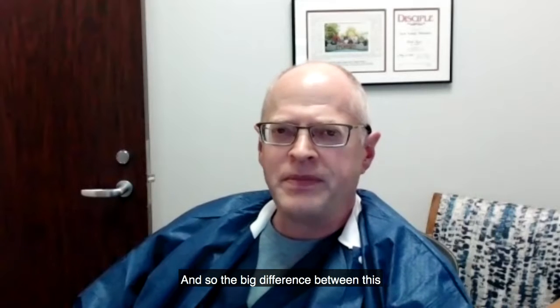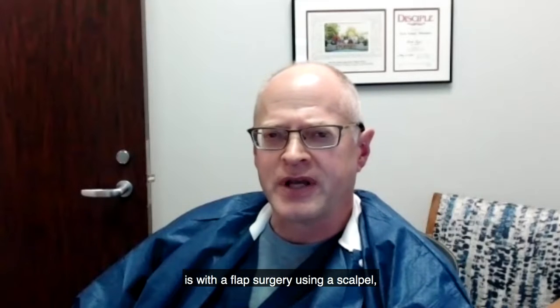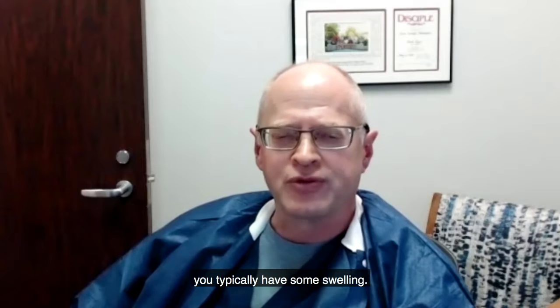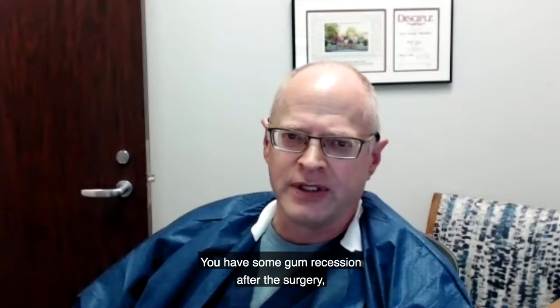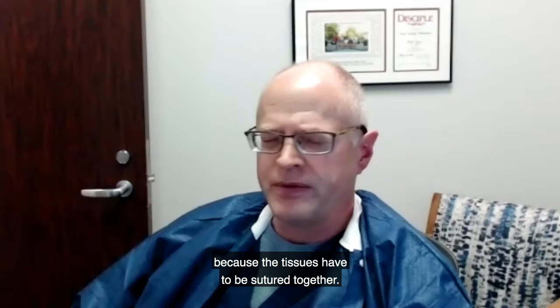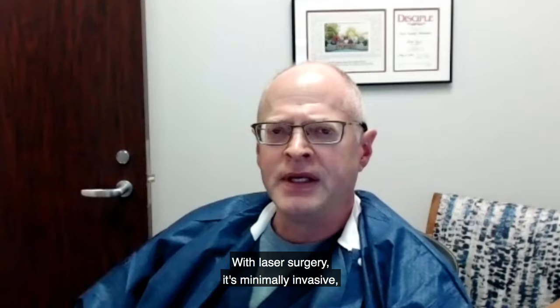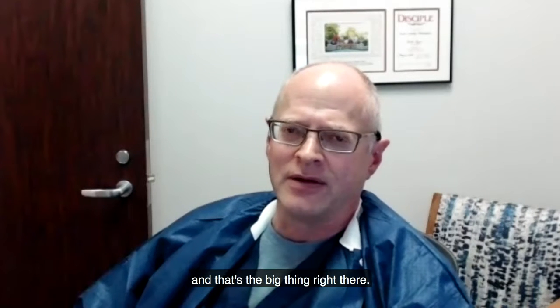The big difference between this and that traditional type of treatment is with the flap surgery using a scalpel, you typically have some swelling, you have some gum recession after the surgery, and the recovery time is longer because the tissues have to be sutured together. With laser surgery, it's minimally invasive, and that's the big thing right there.